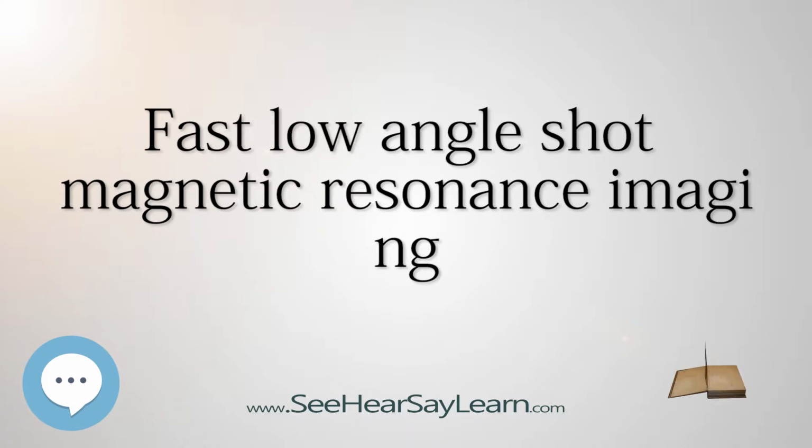Depending on the desired contrast, the generic FLASH technique provides spoiled versions that destroy transverse coherences and yield T1 contrast, as well as refocused versions, constant phase per repetition, and fully balanced versions, zero phase per repetition, that incorporate transverse coherences into the steady-state signal and offer T1/T2 contrast.